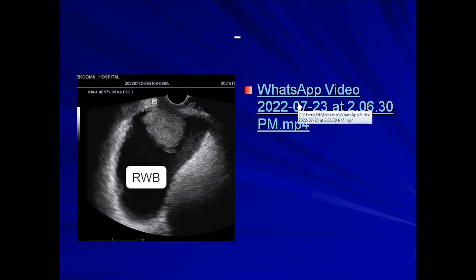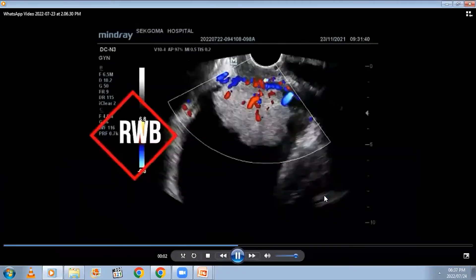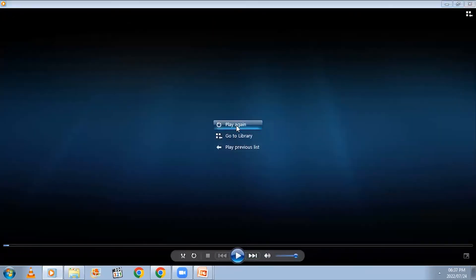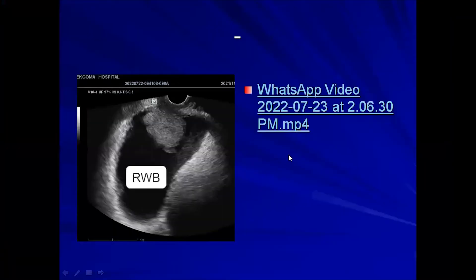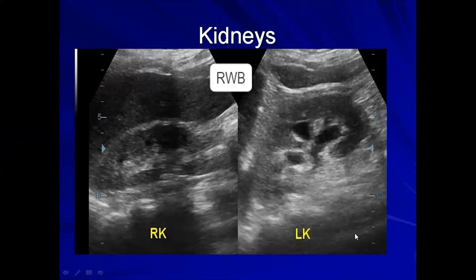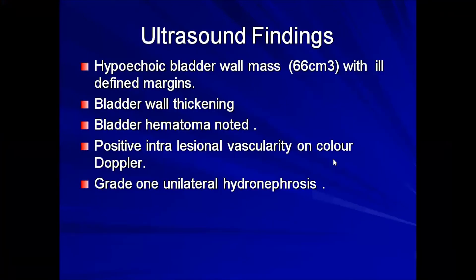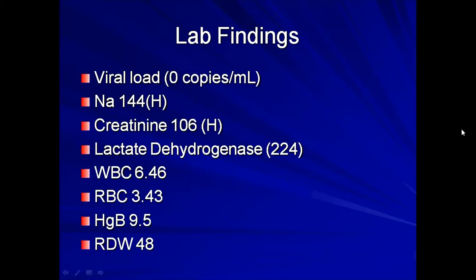From the video, we can see the mass again, showing intra-lesional vascularity, irregularity, and low-level echoes. Looking at the kidneys — both right and left — we can conclude there was ureteric involvement, as evidenced by grade one hydronephrosis indicated by the dilated calyceal system. In summary, the key ultrasound findings are: hyperechoic bladder mass of 66 cc with ill-defined margins, bladder wall thickening, bladder hematoma, positive intra-lesional vascularity on color Doppler, and grade one unilateral hydronephrosis.